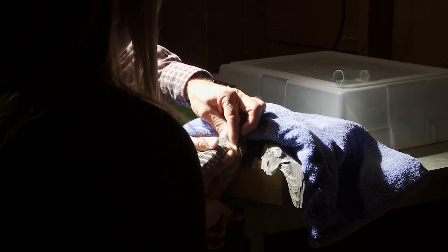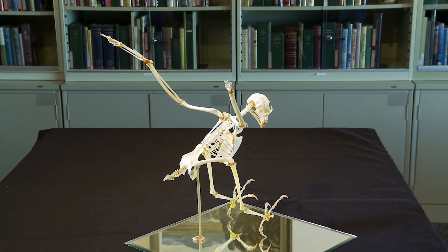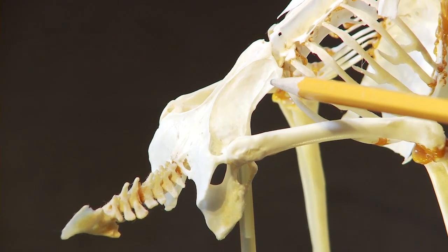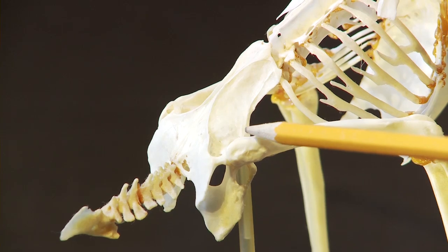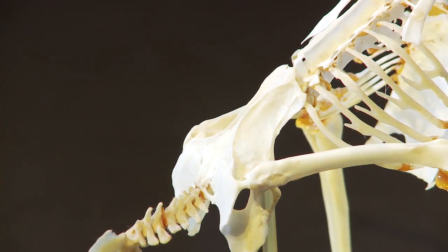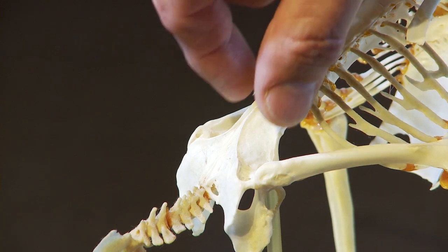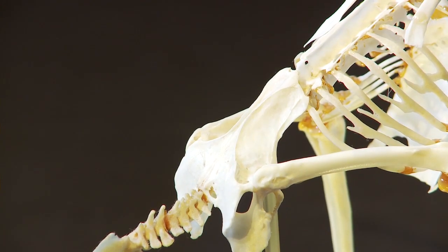This applies pressure to the testes and pushes semen down the vas deferens to the papilla. This skeleton illustrates the anatomy, the location of the testes and vas deferens, and the location where Cal firmly but gently massages the falcon from the back of the ribs to the pelvic girdle several times.